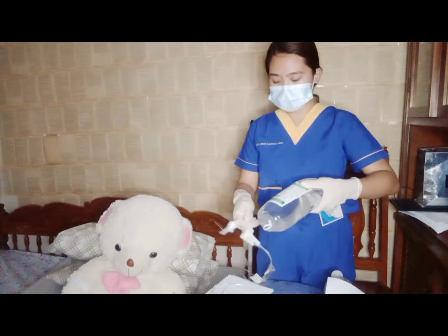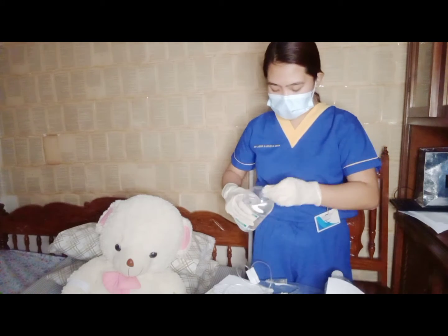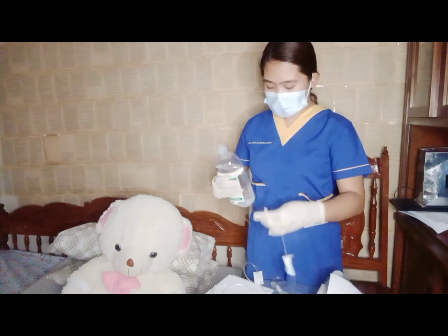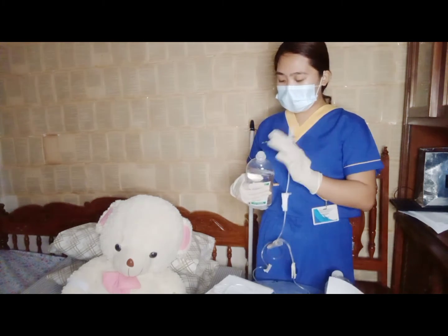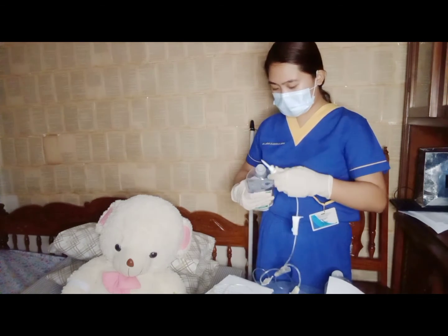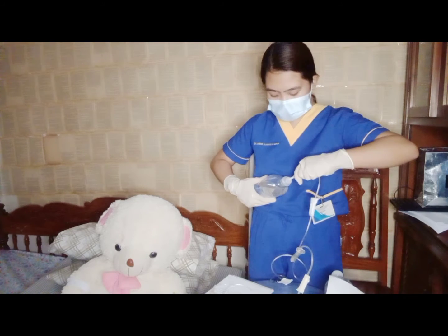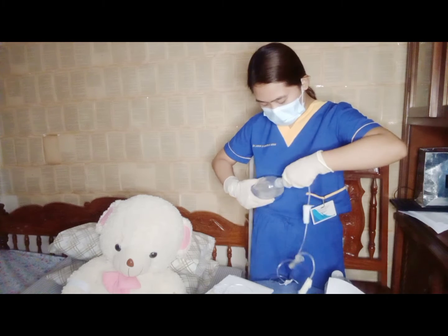Okay, so let's remove the cap. First, let's remove the cap of the spike. Avoid touching the exposed site to prevent contamination. Okay, so using the pushing and twisting method, let's spike it.